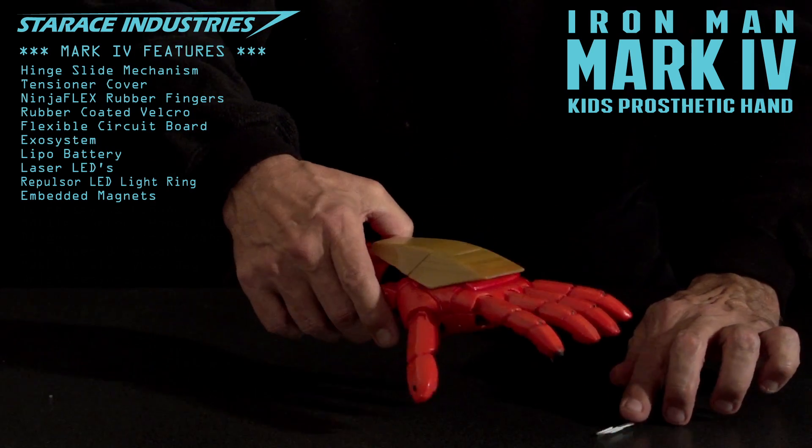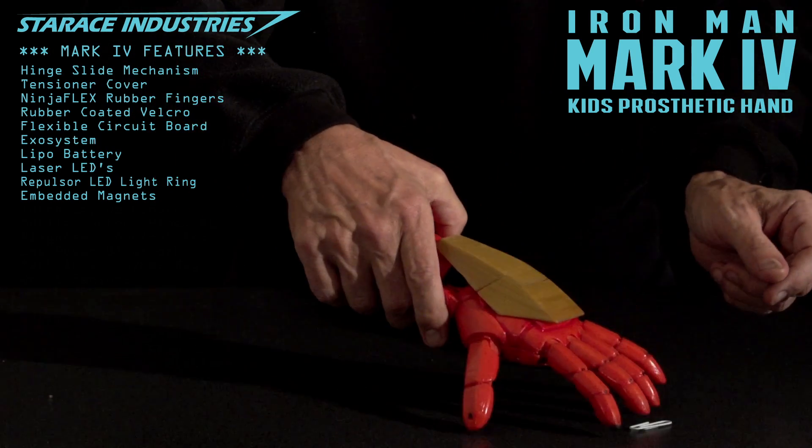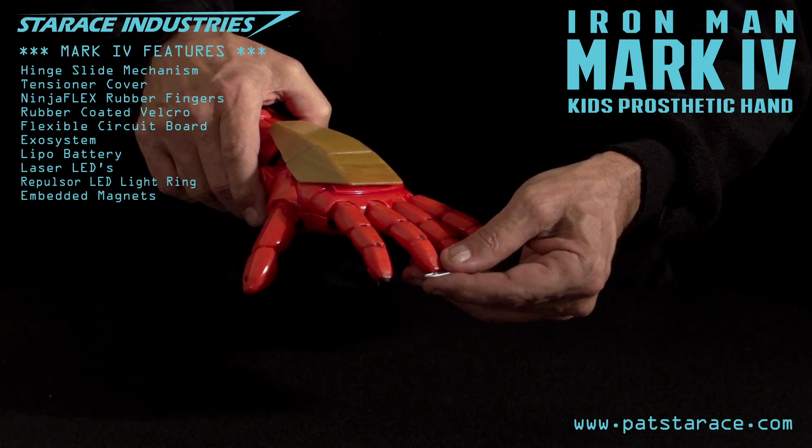Magnets. The magnetic implanting sequence is complete and you'll be able to attract metallic objects. This should come in very handy.